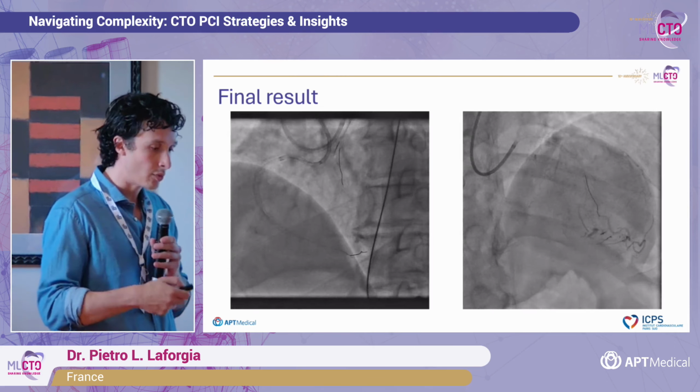But also the good advantage is it has 4 side holes. It allows you to work safely, to maintain perfusion in the coronary, which is a peculiar characteristic of the Expressman. This is in all the sizes from 4 French to 7 French. I almost always use the 6 French with no problems in CTOs and non-CTO cases, because this really helps you during the case without any problem, no ischemia, no ST changes. It makes it very easy.